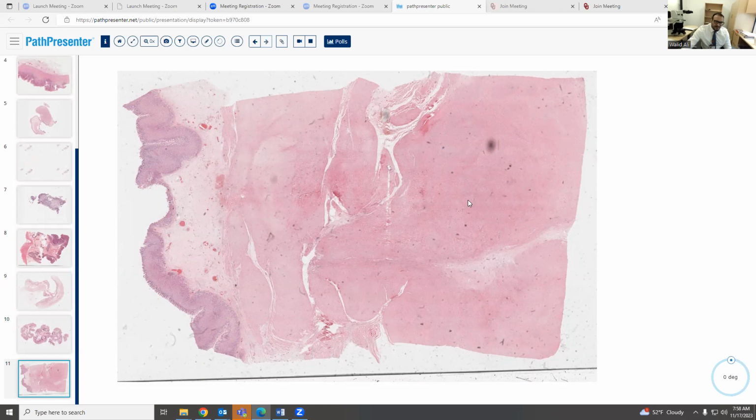It's hard to tell if there's very severe GERD, but usually you can correlate. There is also usually an endoscopic finding in eosinophilic esophagitis. You may see feline or ring shape in the endoscopy. But yeah, the best thing is to biopsy the upper esophagus and the lower esophagus.